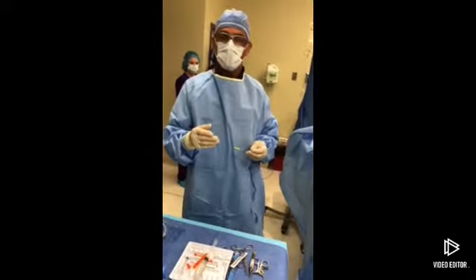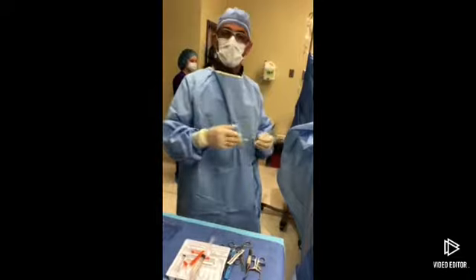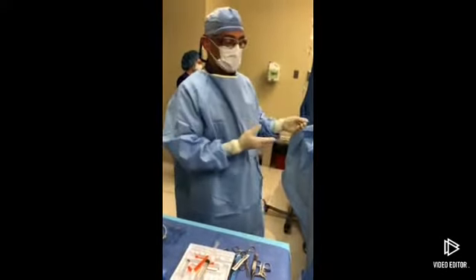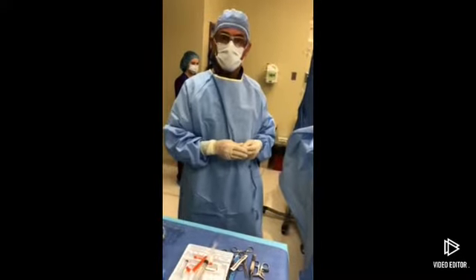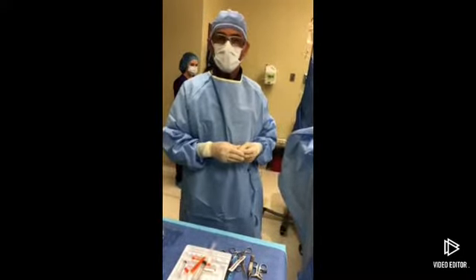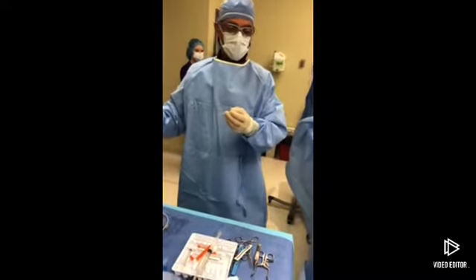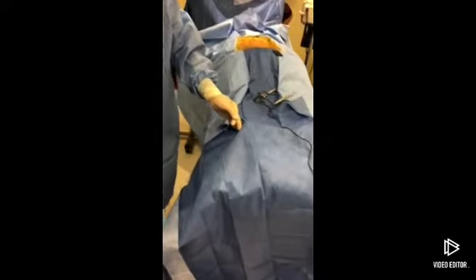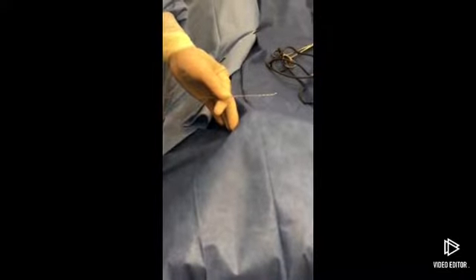This is a treatment modality reserved for patients who have failed most conservative treatments, who have back or neck pain, typically after back or spine surgery. We're with this patient who was kind enough today to let us record and teach a little bit of what this is about. Essentially this involves passing a small wire, as you can see. I'm not sure if you can see the actual lead here, but it's an 8-contact lead and there are metal contacts at the end of this wire.